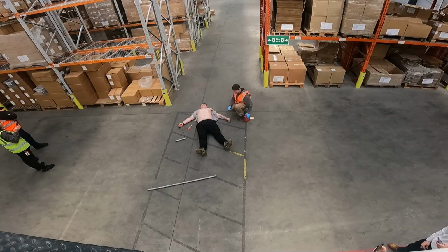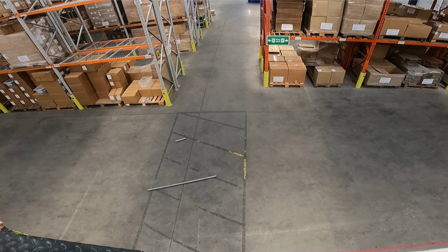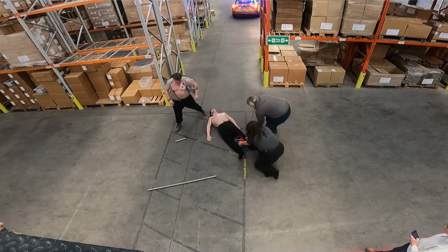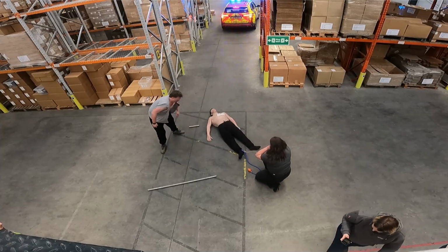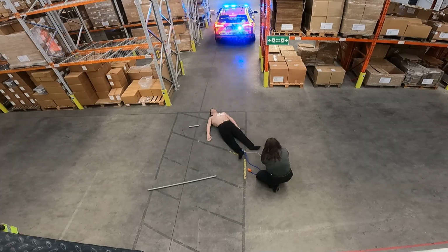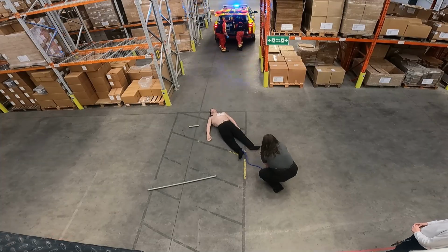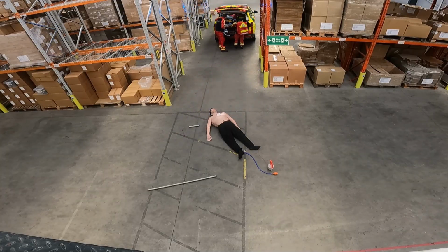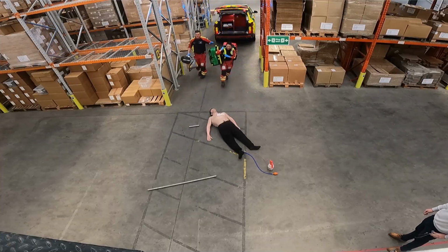What they'll also send is a critical care team to any penetrating chest trauma. Level 8 team arrives. And what they have in level 8 teams is normally a critical care doctor and a critical care paramedic, which we have. So then, what they can see is an unconscious patient lying on their back in the middle of the warehouse with a large open chest injury. The kit that they would have to get is their normal response kit, blood, monitor.